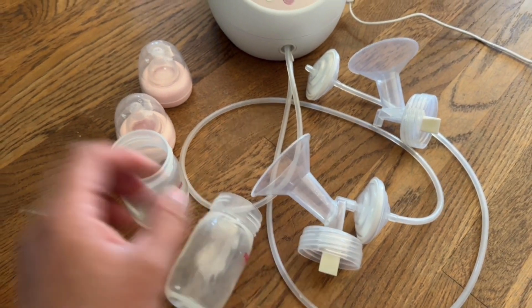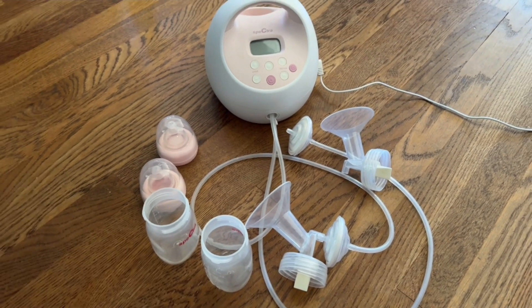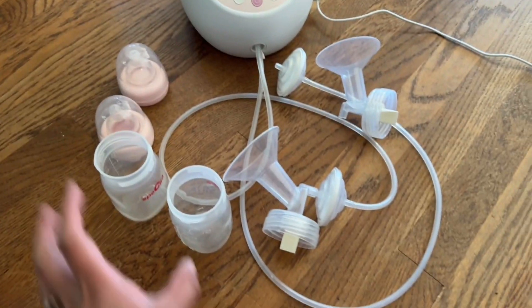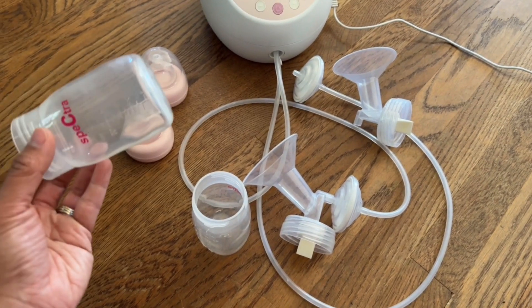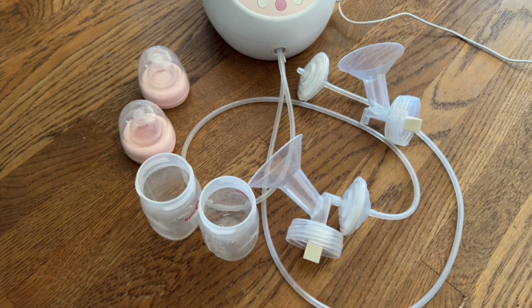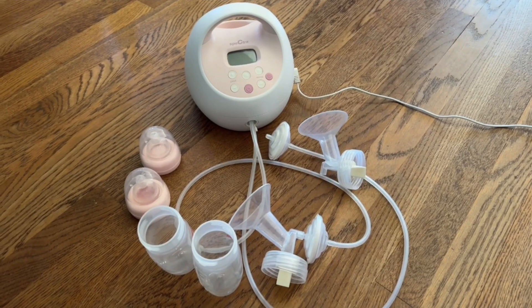This is a great pump. I had it on a cart so it could be movable and I can take it all around the house. To wash all of this, I just took it all apart, put it in a huge bowl, dumped some water and soap in there, let it soak, and then scrubbed it — rather than doing each piece individually, which takes longer. Great pump and I highly recommend it.